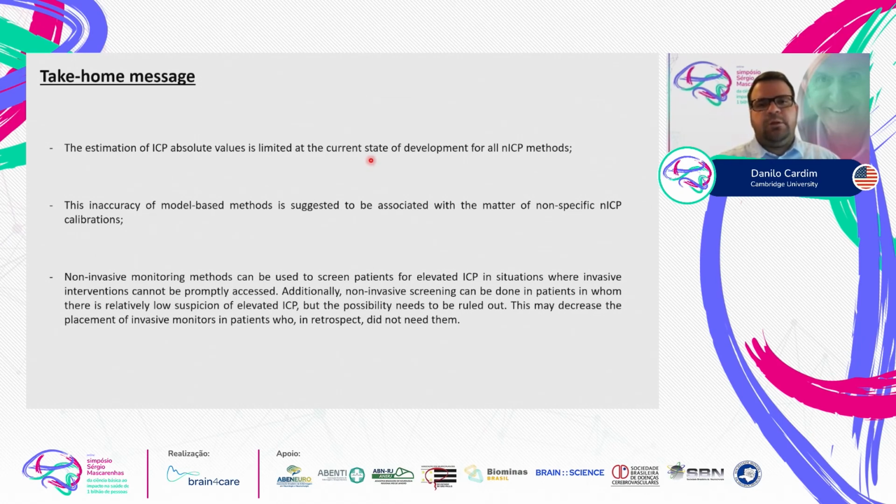None of them are 100% reliable in providing absolute values. All of them have advantages and limitations in this concern, but overall, none of them can be accurately utilized to provide the clinician with absolute values of ICP.